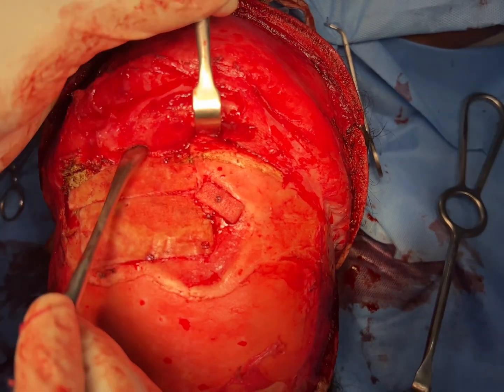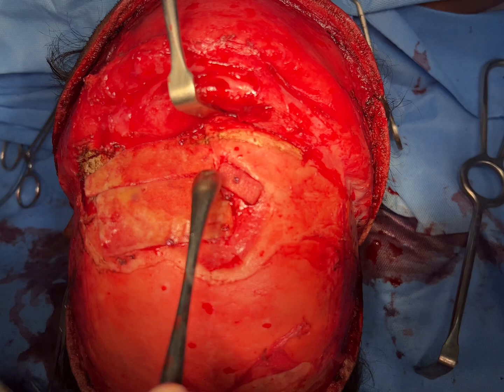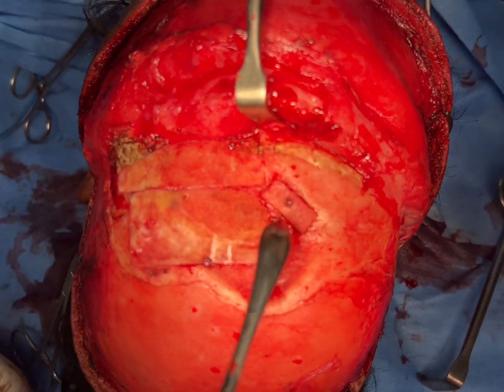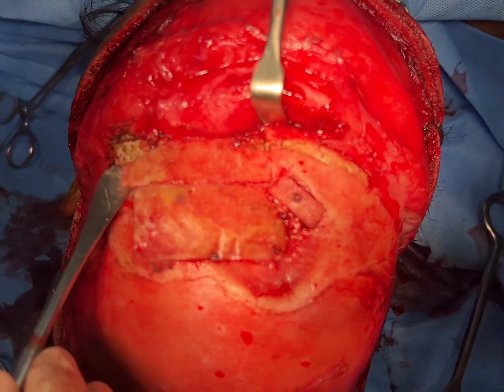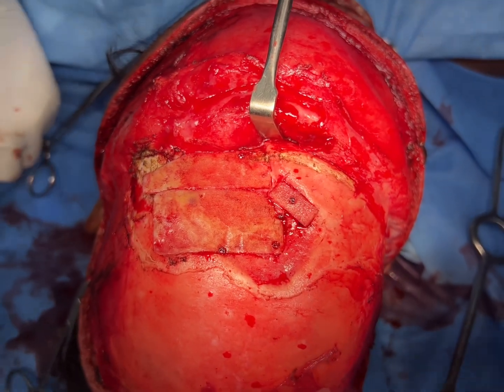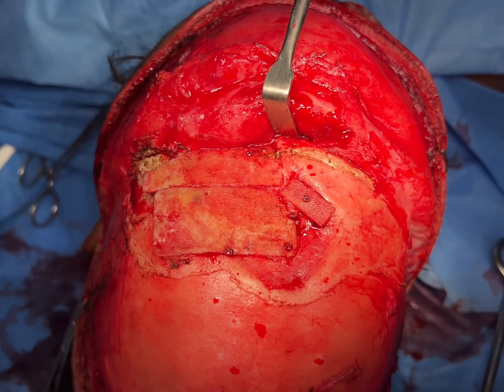There's a total depression and there are issues with the supraorbital rim. They've used one, two, three, four screws to retain three of these implants on the forehead, and it's also not contoured well — you can see it sticking out here. We have to remove these as the first step and then do the reconstruction thereafter.